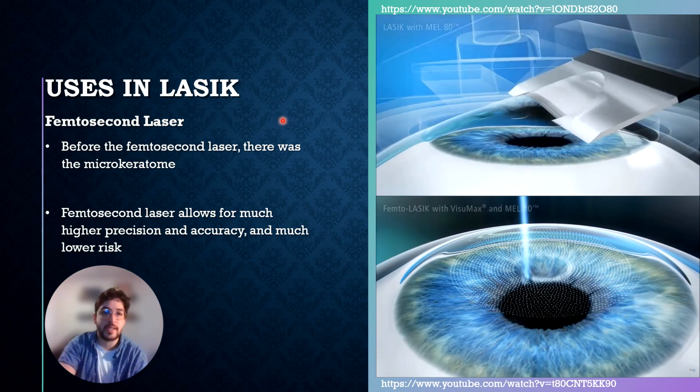And so, more on the femtosecond laser. Before the femtosecond laser, there was the microkeratome. Not many practices use the microkeratome, if any at all, really. It has increased risks of rippling, and healing is not the same as with the femtosecond laser. But what they did before the conception of that laser was this microkeratome. It's basically just a blade on a track. They put that track on the eye where they want it, and that blade will slide forward and take off the top 2 layers of the cornea, so that we have access to the stroma, and that way the excimer laser will do its trick.